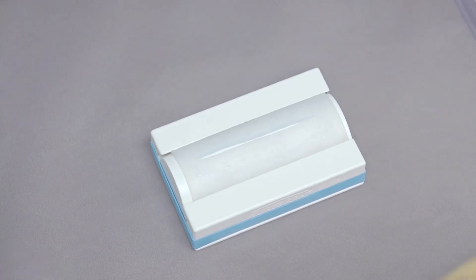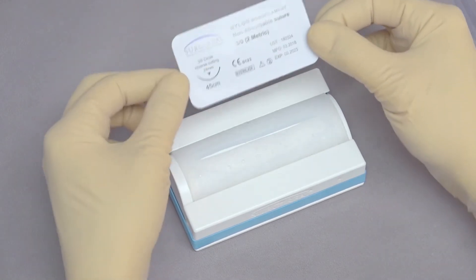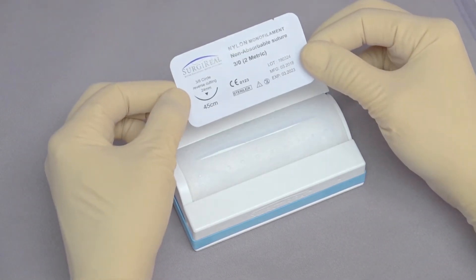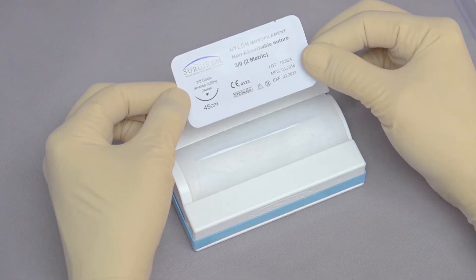We're going to place this now in the perpendicular fashion to our body. To suture today, we're going to use three-zero monofilament nylon suture with a reverse cutting needle.